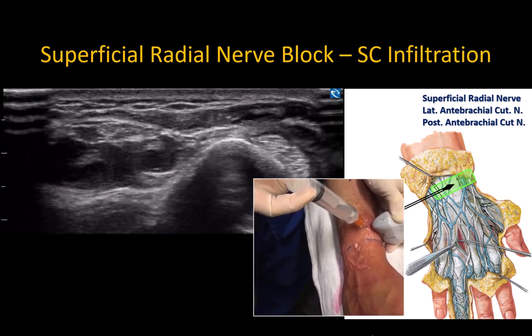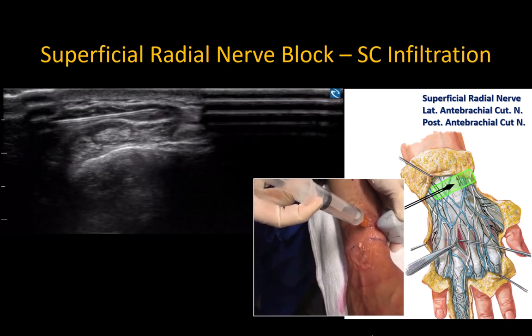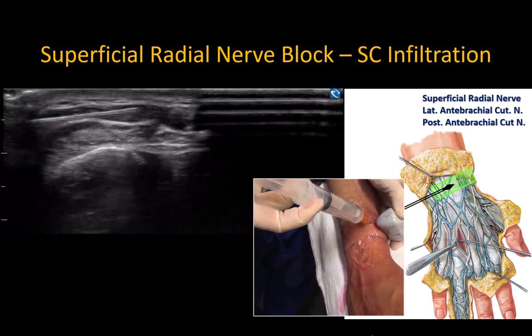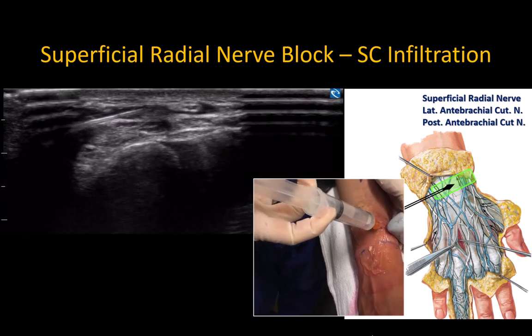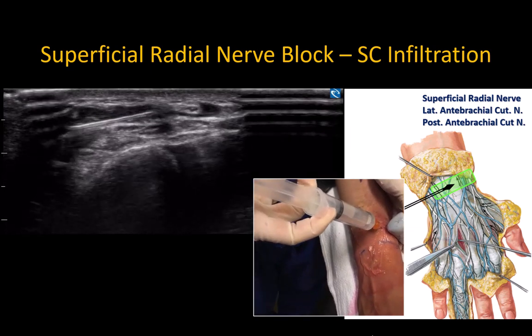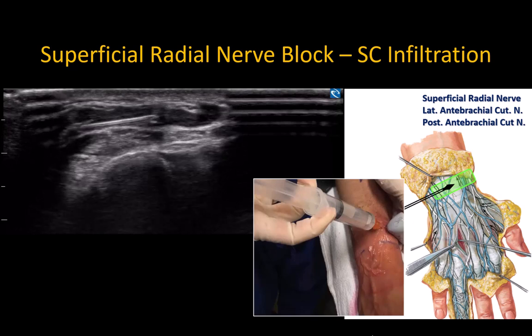Ensure that you follow the curvature of the wrist with appropriate needle manipulation. Open up a safe plane of fluid with local anesthetic injection before advancing the needle. The nerves often become visible as local anesthetic spreads around them.